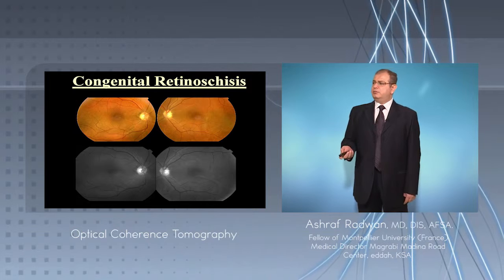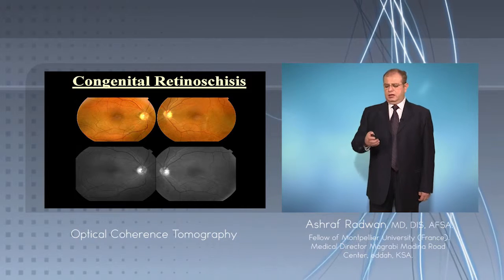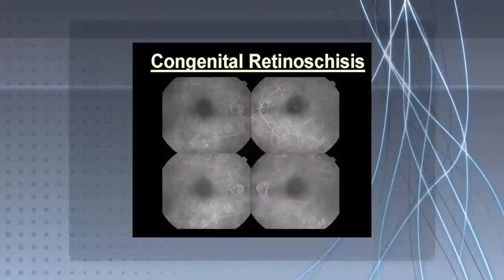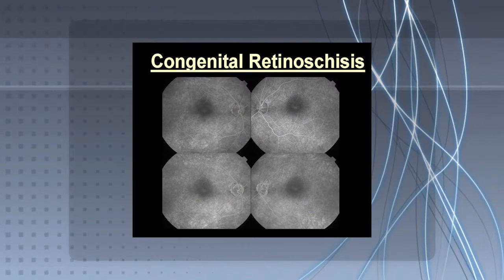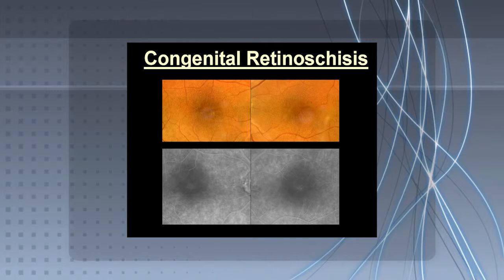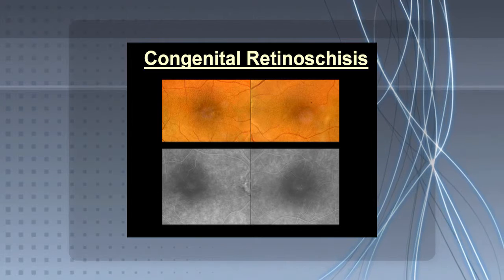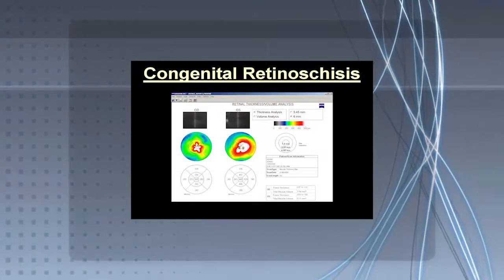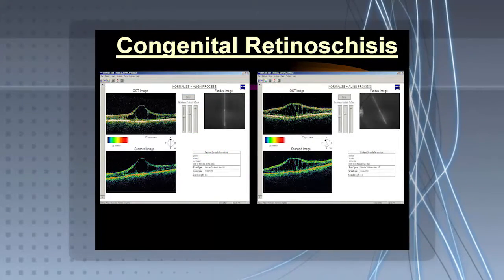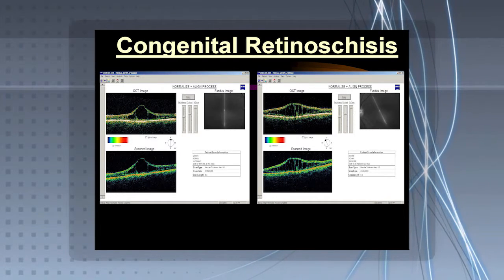In congenital retinoschisis, before, we could see the cogwheel appearance of the fovea, and here, as we see in the fluorescein angiography, there is an area that looks like RPE changes, while the OCT clarified it for us. This is a magnified picture of the fundus with a cogwheel and the cystic spaces in the fovea. In fact, with the OCT, we found a very huge and important cystoid macular edema. Congenital retinoschisis is a severe cystoid macular edema in the macula in both eyes.